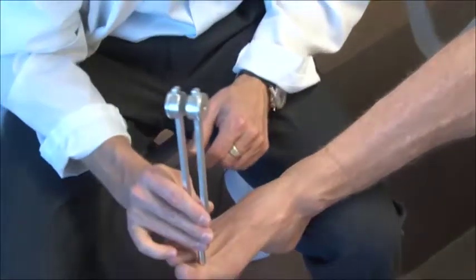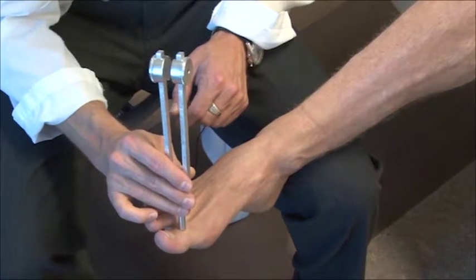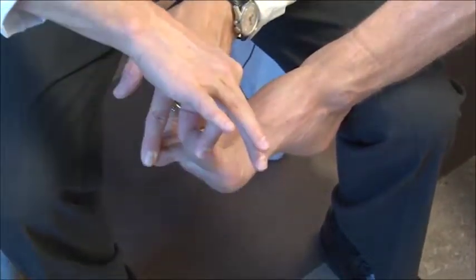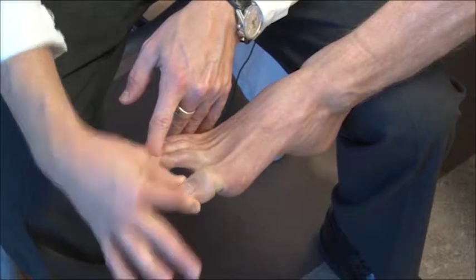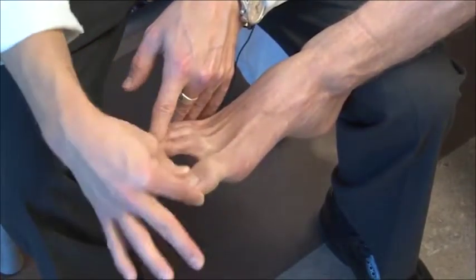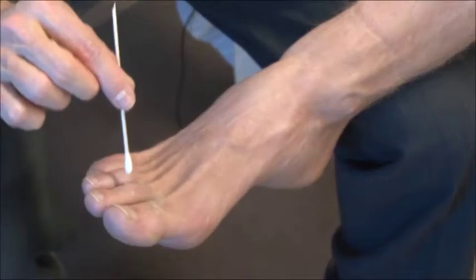Assessment of vibration is performed by placing the vibrating tuning fork on the distal joint of the great toe and asking the patient to identify when the sensation of vibration extinguishes. Proprioception is assessed by parting digits 2, 3, 4, and 5 from the great toe, holding the great toe on the lateral aspects to reduce pressure sensation. With eyes closed, the patient should identify whether the great toe is pointed up or down. Pinprick can be assessed by breaking a wooden applicator and asking the patient to close their eyes and identify whether the stimulus applied to the distal foot and leg is sharp or dull.